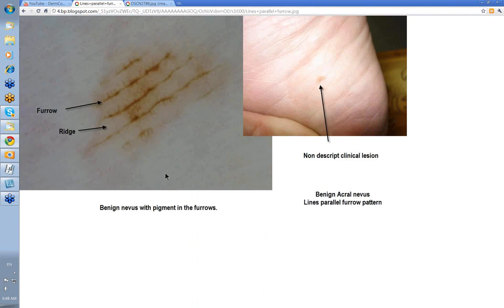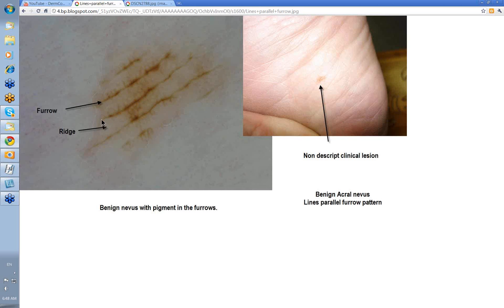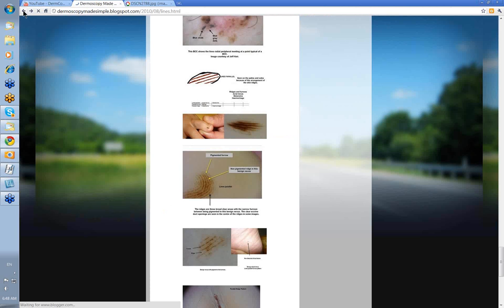This is probably an even better example. The lesion looks very nondescript — there's really not a lot to see clinically. But when you put the dermatoscope on it, you see the pigmentation in the furrows. There's a little bit of cross-hatching of pigment going across the ridge, but always look at the edges of a lesion to see where the pigment is, and that will generally tell you this is just a nice simple parallel furrow pattern.